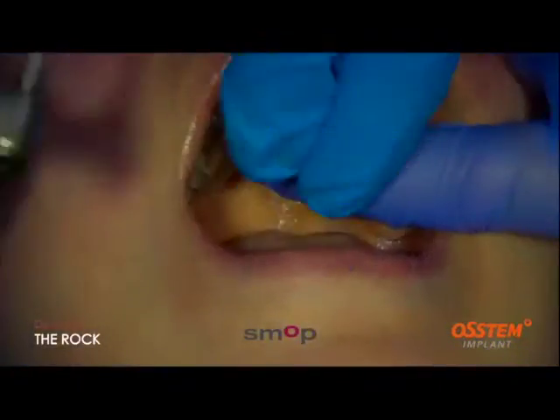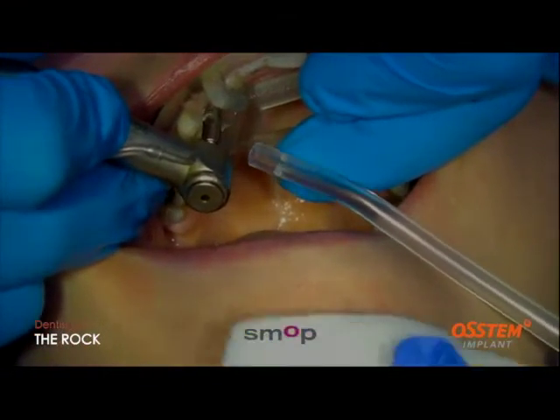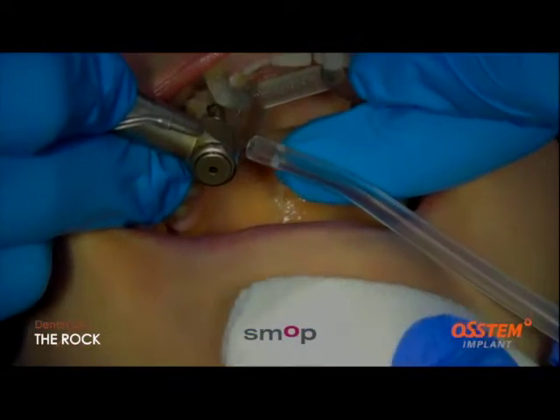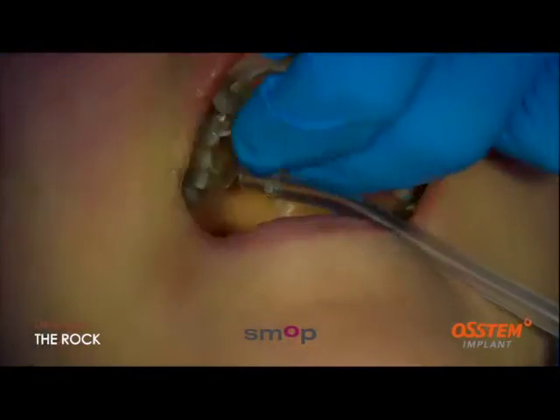So, why I wanted to do that is so that you can see when I place this through here how snug a fit it is. It is a very, very tight fit. Maybe I'll try and get this a little bit further away.